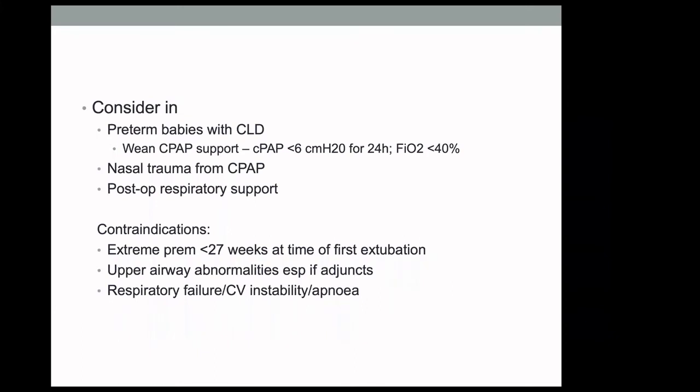You could also go to Vapotherm if you're struggling with nasal trauma from CPAP. And also it might be useful in babies who have been intubated primarily for a surgical procedure and then need to go on to some form of respiratory support postoperatively.